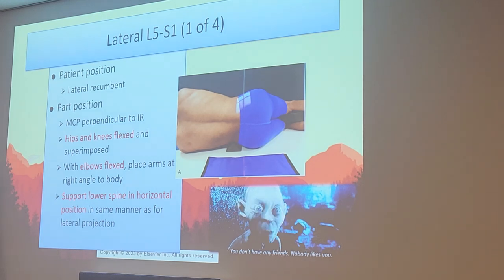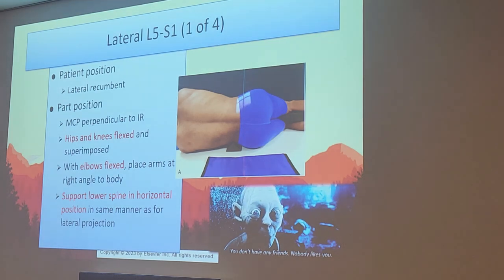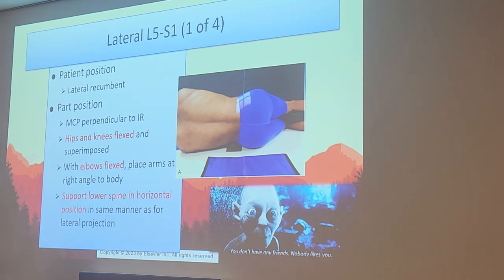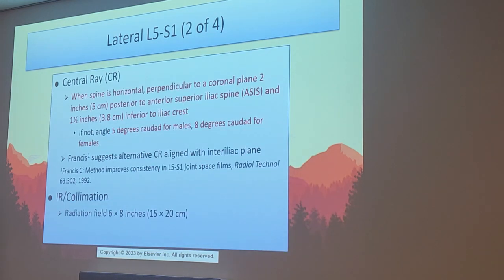But I will tell you guys, just based on my personal experience, my personal two cents, despite any of these so-called variances, this is my go-to number: I've always done a 7-degree caudad angle on every patient I've ever had. It almost always works out. You're going to see these variances, but for me, I'm going to use 7. 7's a lucky number, it works for me every time. That's my go-to. There's also a little positioning trick, I think I have a picture of it coming up, that will help you nail that centering every single time.